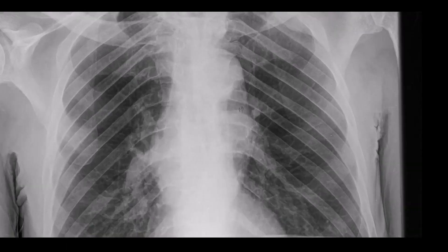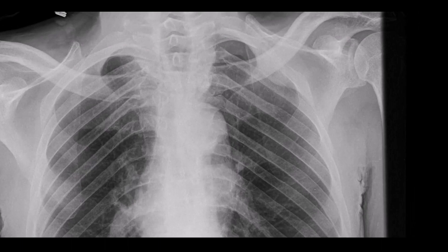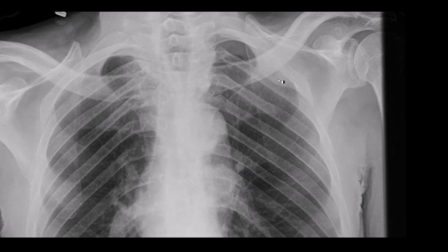Therefore, the impression for this examination is that there is a pleural-based mass in the left upper lung with adjacent rib destruction. There is superior mediastinal widening, some of which may be vascular, although there is suspicion of mass or adenopathy higher up in the mediastinum.